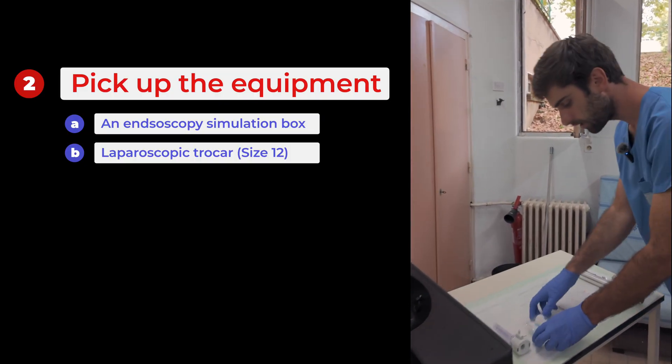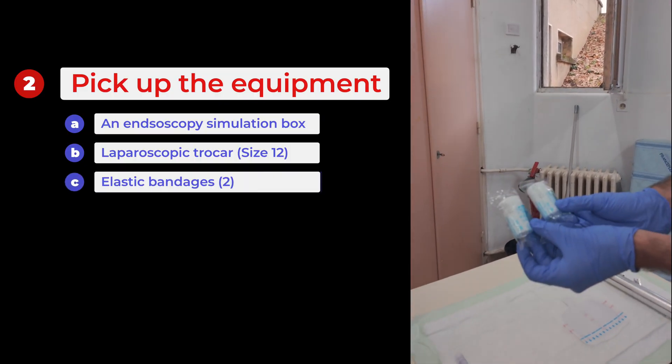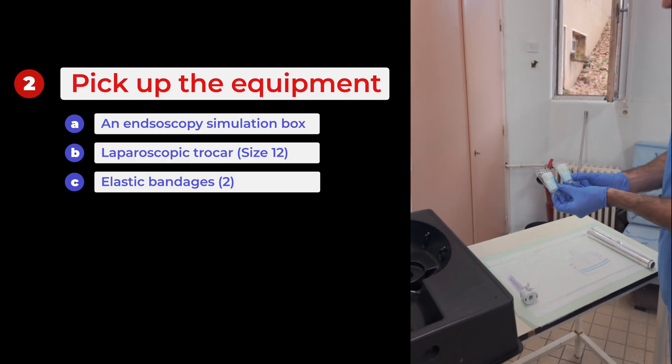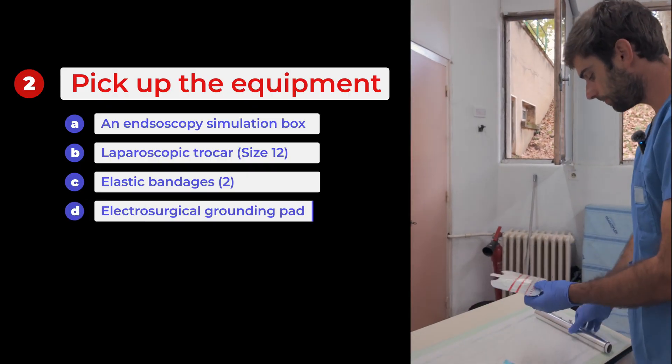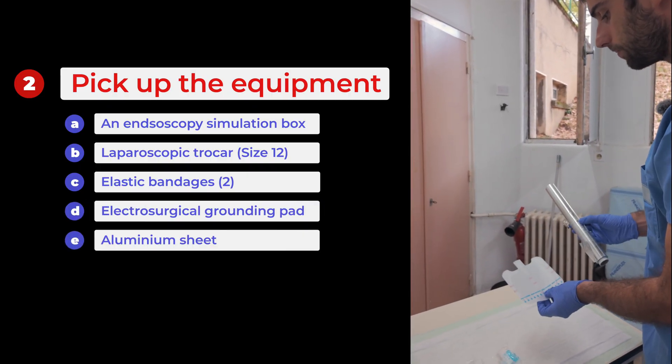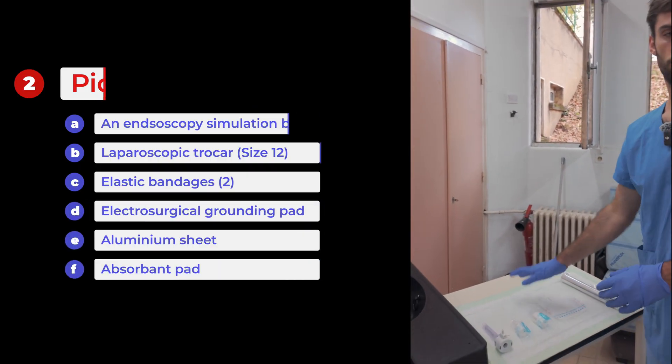Next, we need two elastic bands meant for bandaging, which will be used to close the colon distally, an electrode, aluminum foil to ensure conductivity, and finally absorbent paper for keeping the box clean.